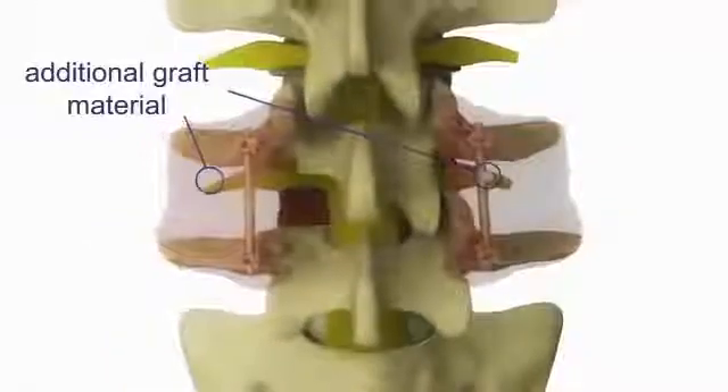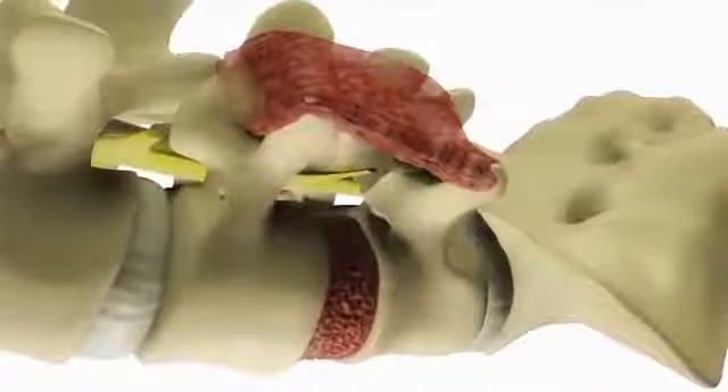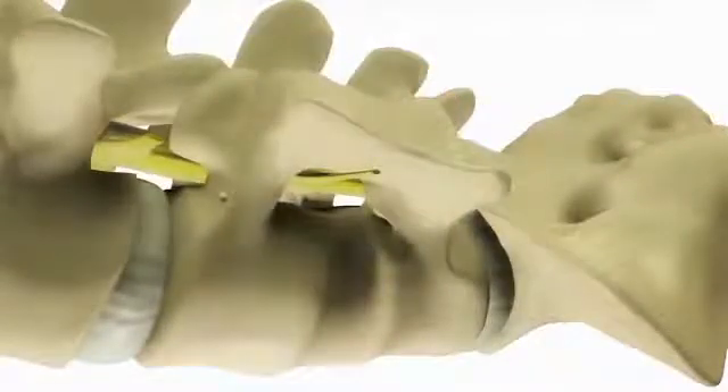This holds everything in place as it heals and allows for more activities after surgery. Over time, the vertebrae will grow together or fuse. After surgery, patients typically stay in the hospital three to five days.